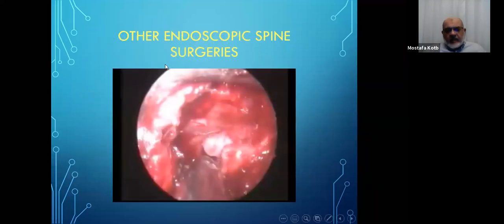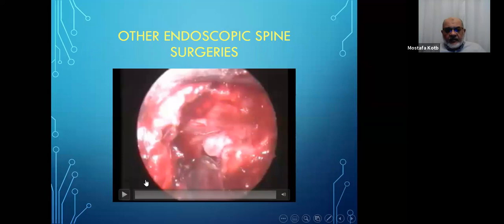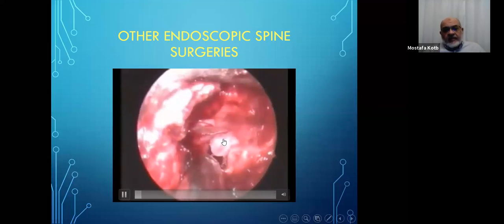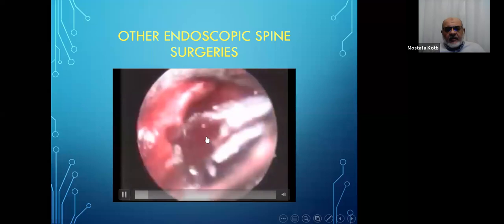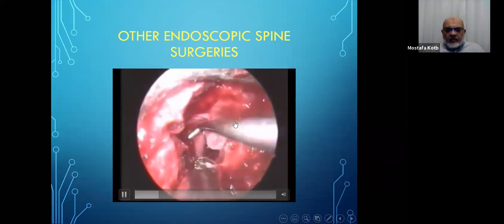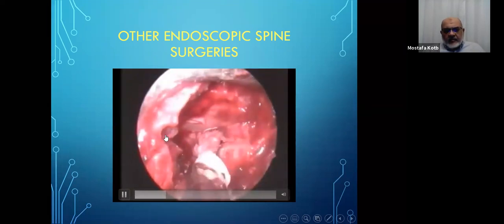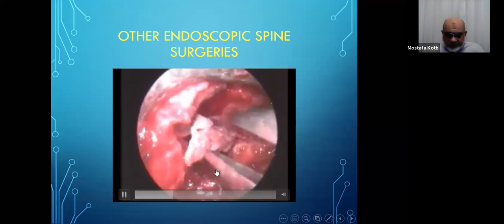I'll show you here some, not lumbar disc, but some other techniques that I use with the endoscope for the spine. In this video you can see a case of cervical disc prolapse with a lateral disc herniation. This is the posterior approach. You go posterior to the lamina, and here I usually use the drills to drill out the lamina and part of the facet joint to expose the nerve root and the disc material just lateral to it. And here you take it out piecemeal, completely, using the rongeurs.